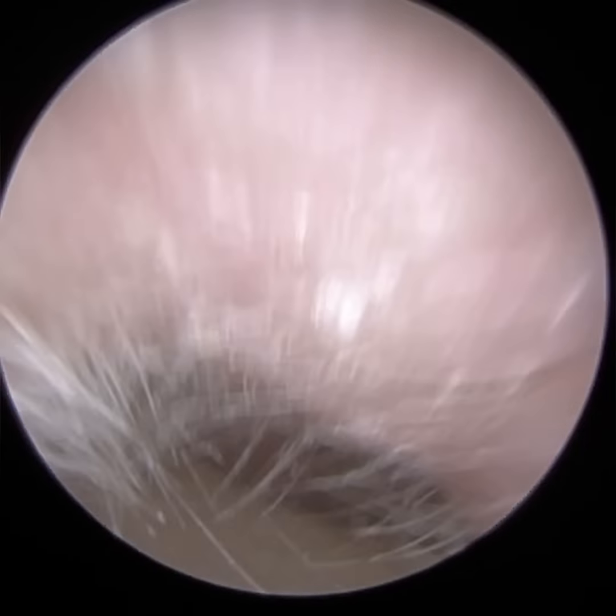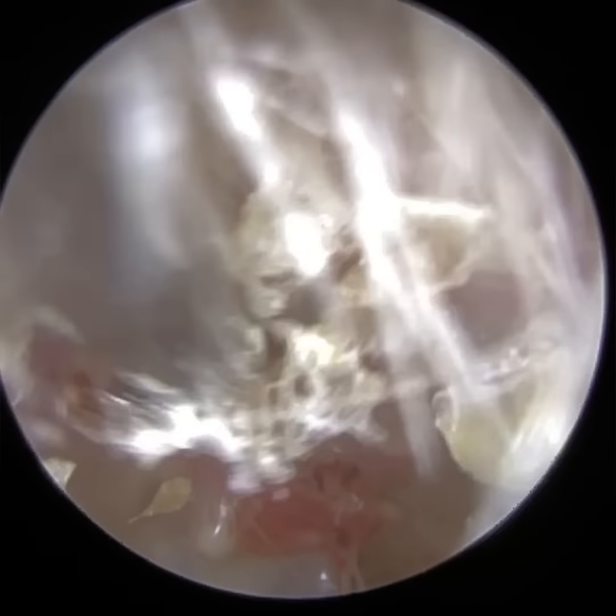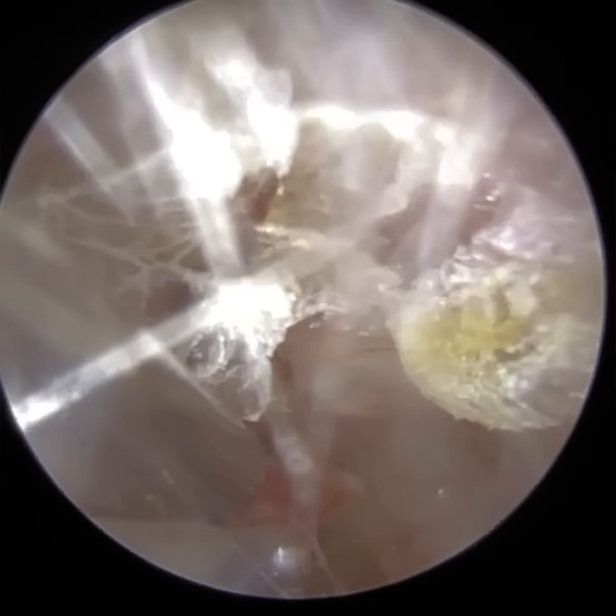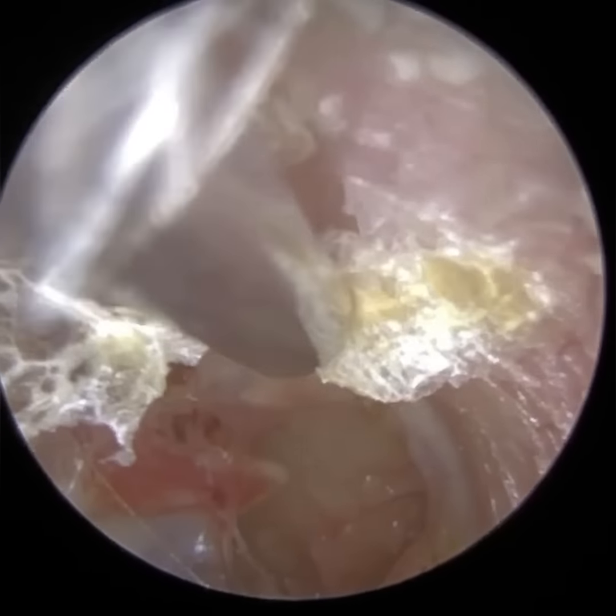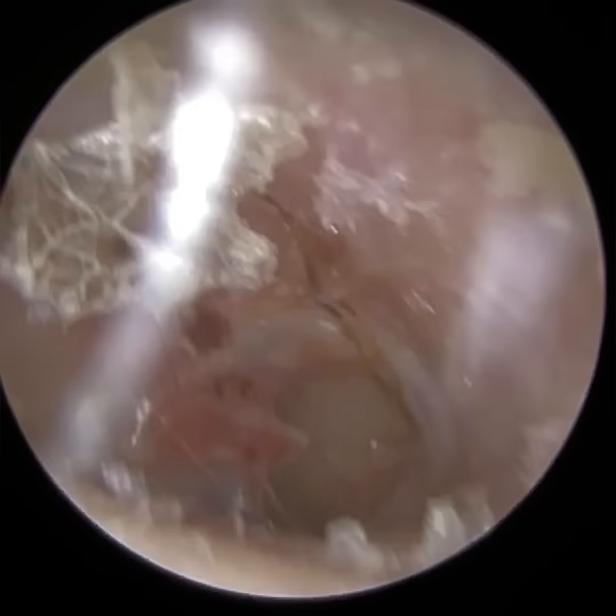The rim of the eardrum is called the annulus. It's made up of fibrocartilage, and if you get a perforation that extends to the annulus and it encompasses 4 quarters of the eardrum, we call that a total perforation. But in this case, you could call it a subtotal, I would say.